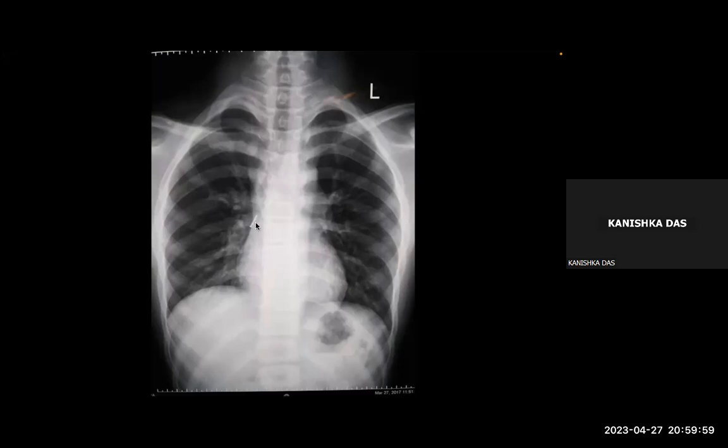What other changes are you seeing on the right side? Based on that, a little mediastinal shift towards the right. A little bit. The trachea is shifted towards the right side. Okay, a little bit maybe. Yes, sir. What about this zone? Yes, consolidation. Yeah, there is a loss of volume here. Not so much here. This is still okay, but there's a loss of volume here.